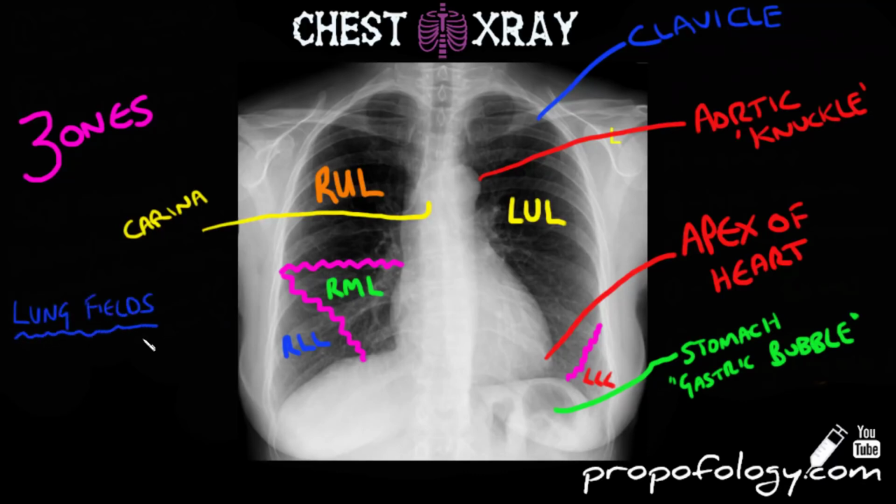We're going to be doing more videos on certain pathologies you can see on chest x-rays, because whenever you're looking at the lung fields, you should consider whether there are certain things within them. You should consider, is there any consolidation in any of the lobes that we've talked about. You should consider, are there any collapse of those lobes? You should consider, is there any pneumothorax, so is there air in the pleural cavity surrounding the lungs until the lung fields not quite go to the end?